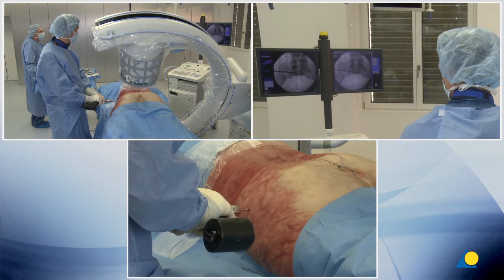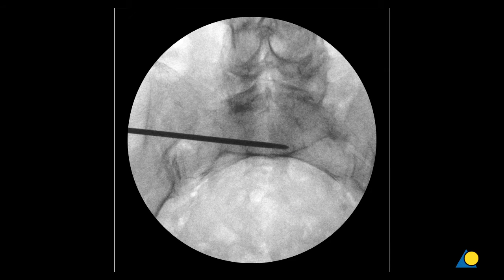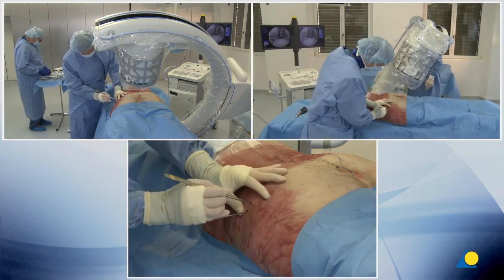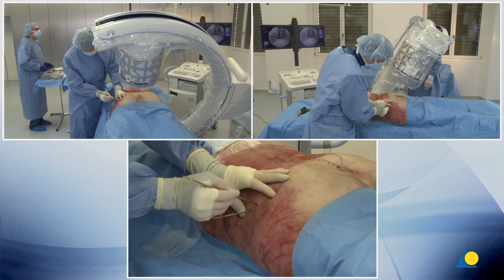The position for an iliosacral screw for a sacrofracture, or a screw to traverse to the contralateral side, will be demonstrated with an S2 iliosacral screw. A second stab incision is placed dorsal and caudal to the S1 stab incision.